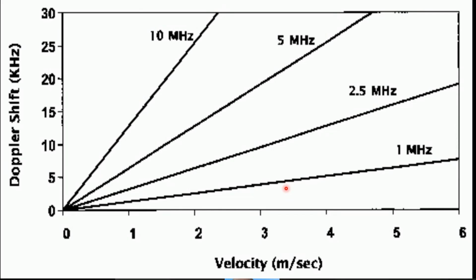paradox. The second paradox is the frequency. For us to get the best image, we need a high frequency transducer. That is applicable for two-dimensional echocardiography. But for us to get the best Doppler velocity profiling, we need a low frequency transducer. That's what is being shown here.